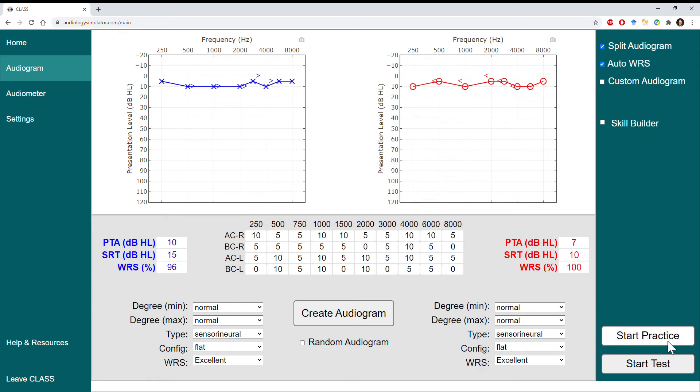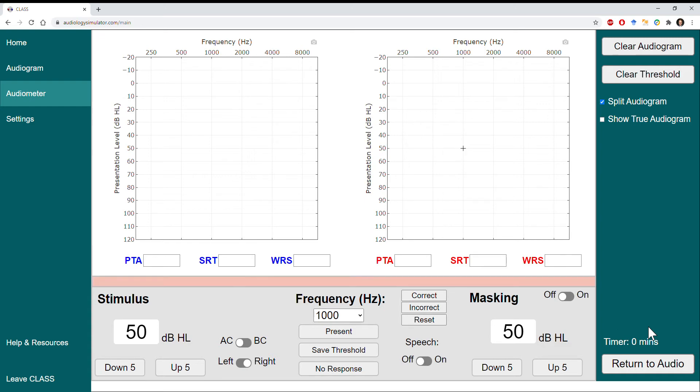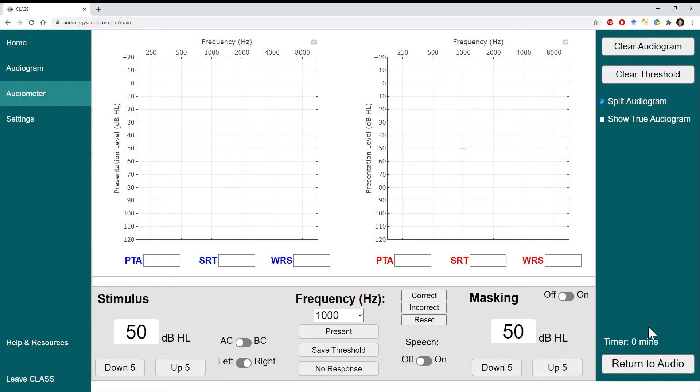We'll click 'Start Practice' so that we can check our work as we go along. We'll start presenting at a level that's good and audible for the patient — 50 dB; the default should be sufficient. I saw that the response light lit up, so I know that I'm above the patient threshold.